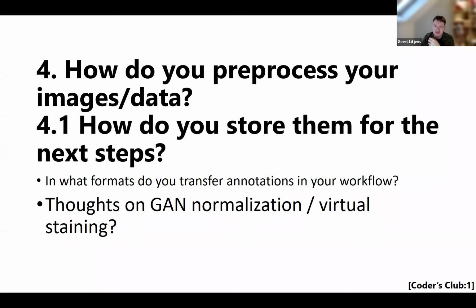So as an author of a paper doing GAN normalization, I can respond a bit to that. Excellent. In a positive way, I completely agree with you. The best way to make your network robust to variations in slides and batch effects is adding more data from diverse sources. Maybe there's somebody in the call who disagrees with that, but I hope not.